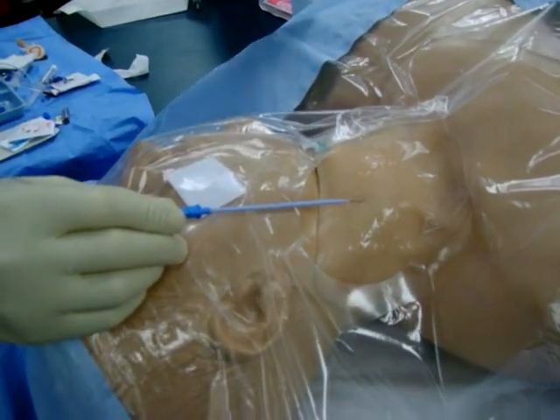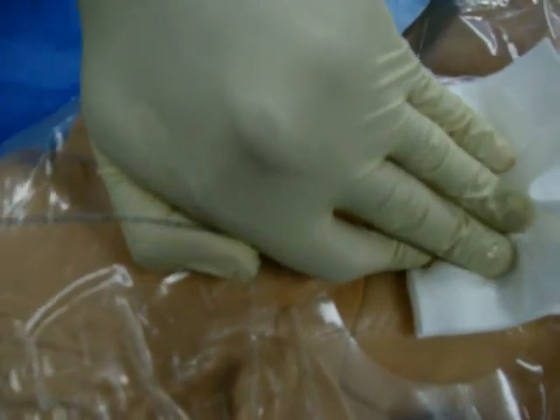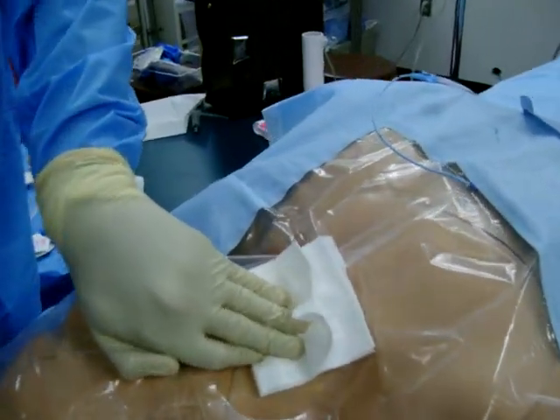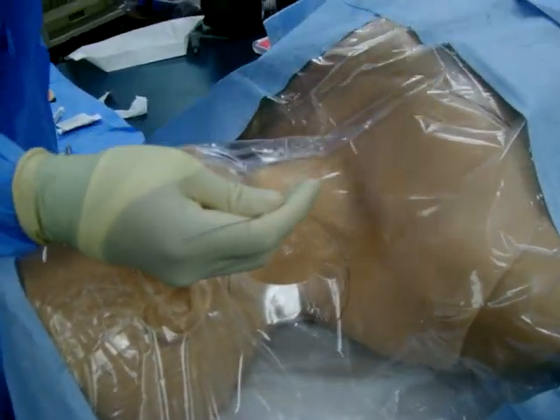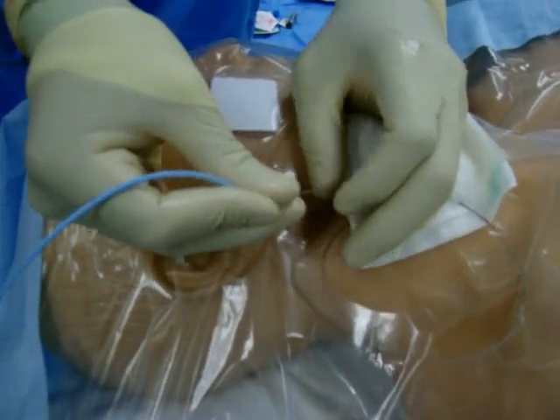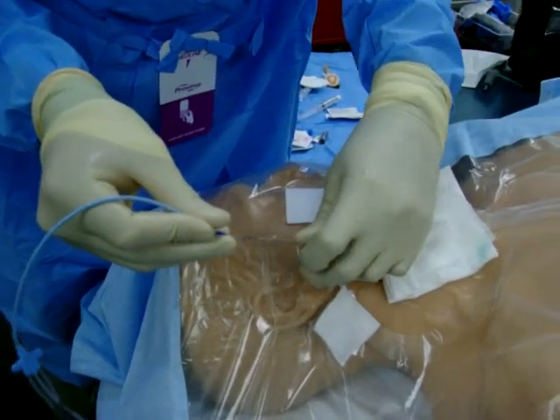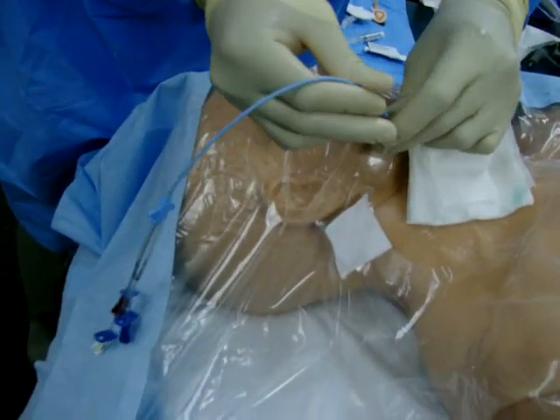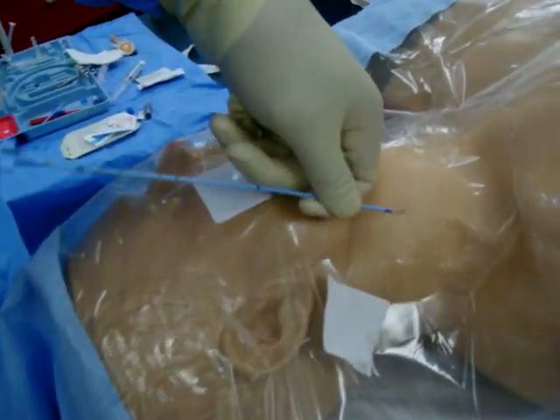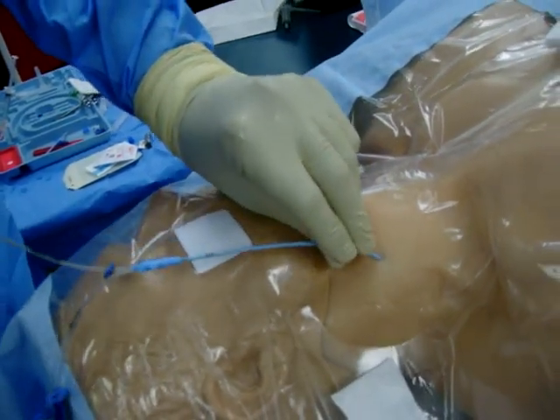Once the dilator comes out, you want to have some gauze ready because you just poked a hole in somebody's jugular vein and they're going to bleed. I like to secure my wire so it's not flopping around. Go ahead and grab your central line — I'll loop the wire, hold on, and you can even leave your gauze here if the patient's still bleeding. Anchor it here and then grab your triple lumen catheter and insert it through the central port, just feeding it in here. Wait for the wire to come out the back of the middle port — you can see the wire right here. Go ahead and grab this wire, then insert the catheter into the patient. Use a little bit of force and push it in; of course if you feel resistance, go ahead and stop.